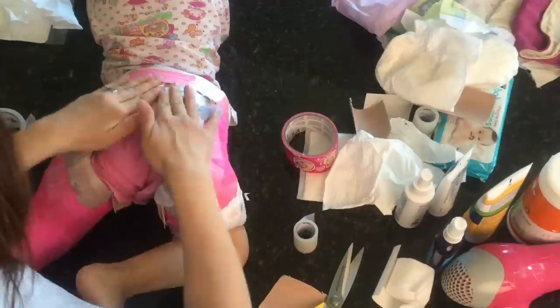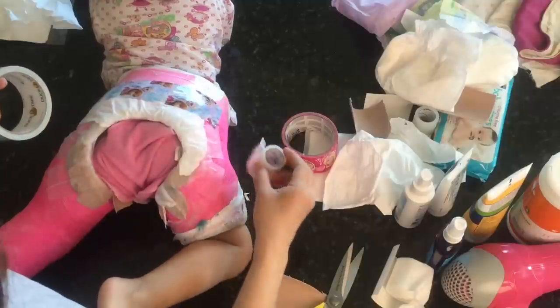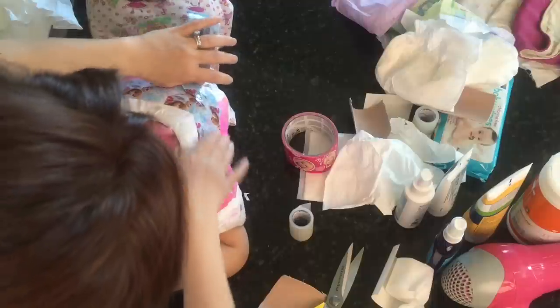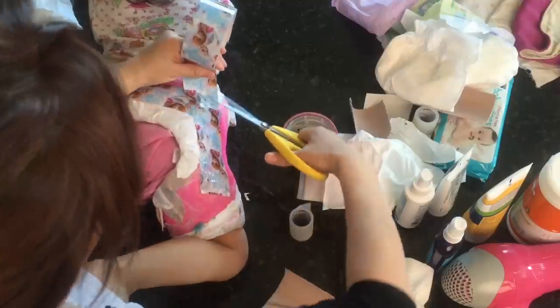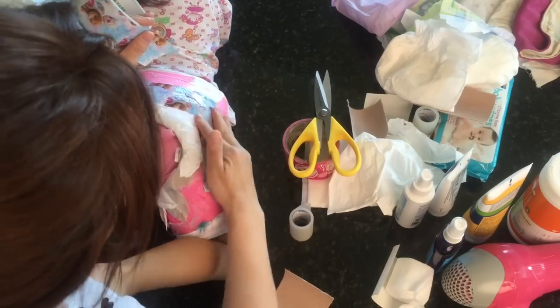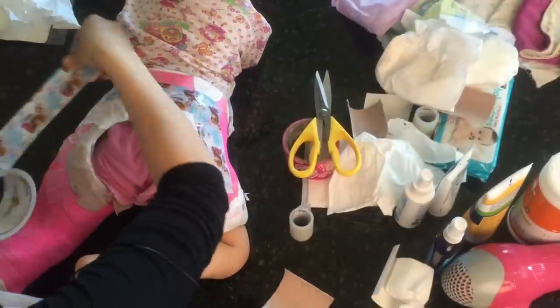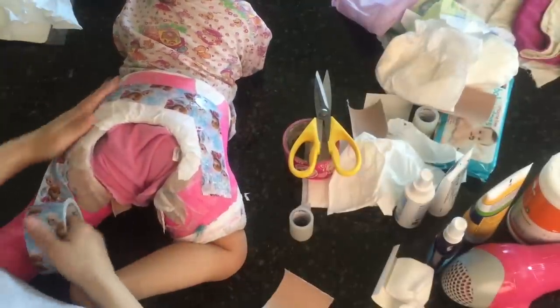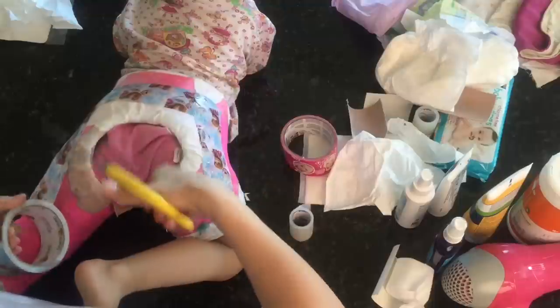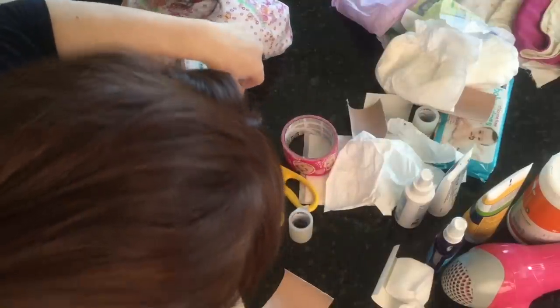The duct tape was much easier to find than the hospital tape. Make sure you get the soft kind — the hard glitter ones don't stick well. Put the duct tape around to seal it off so when she wears clothes it doesn't come off. See how nice it looks — you can go over wherever it needs that extra coverage.